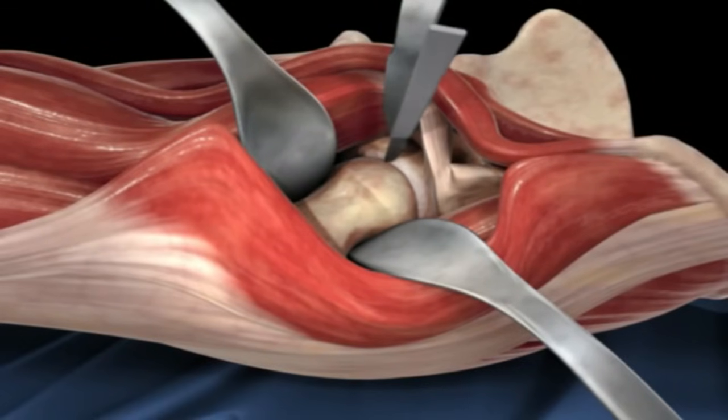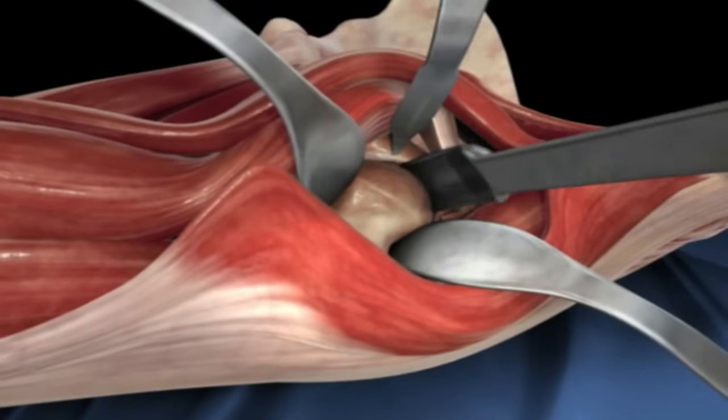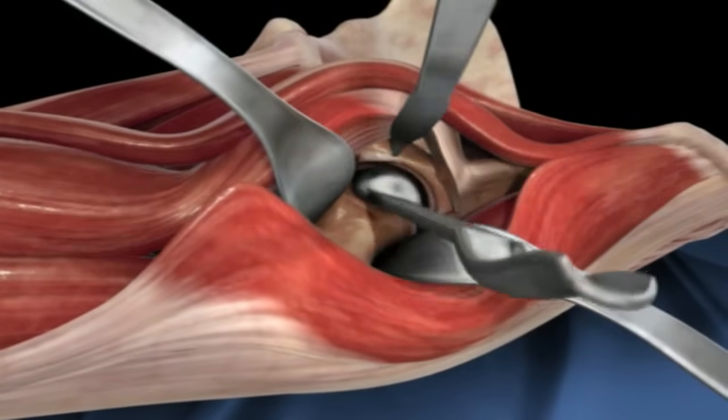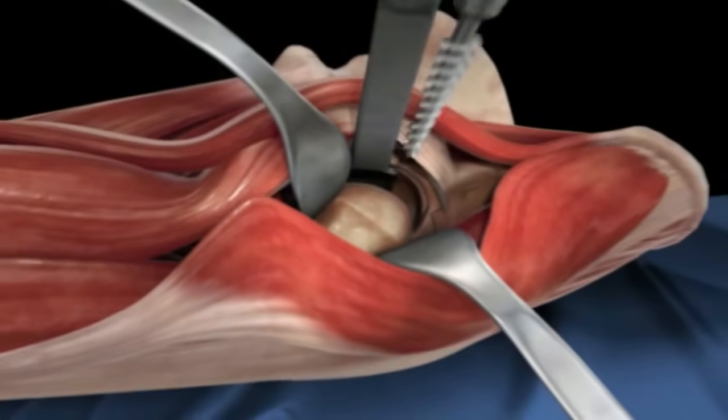Next the scalpel is being used to remove some cartilage and tissue, giving better access to the hip joint. A hip skid is inserted between the ball and socket to allow the head to be pried out of the socket, or acetabulum.